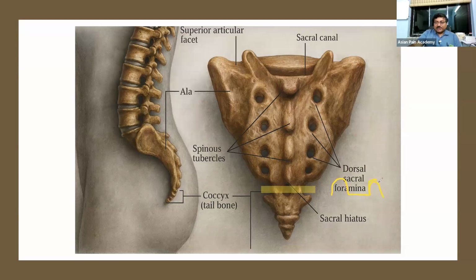It will be almost similar height. So the cornu and in between a depression. And also there is another line at the top. This is representing the sacrococcygeal ligament. This area will be highly hyperechoic because of the bone. This area also will be hyperechoic and this area will be hyperechoic. In between, the echoes will move like this, and will show you this pattern.